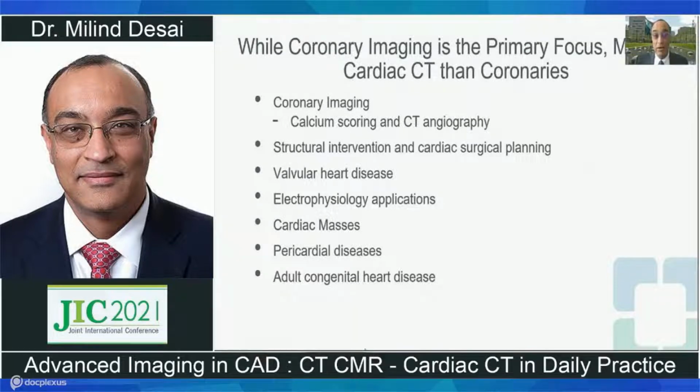There are many electrophysiology applications, including planning for left atrial appendage occlusion, evaluation for non-coronary cardiac situations like cardiac masses, pericardial disease, adult congenital heart disease, etc. So let's walk through what some of the indications are and how we can manage these patients, how we can incorporate CT into our daily practice.